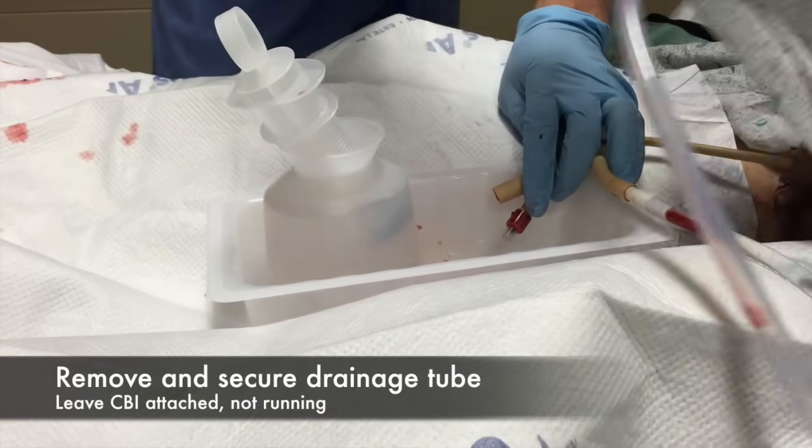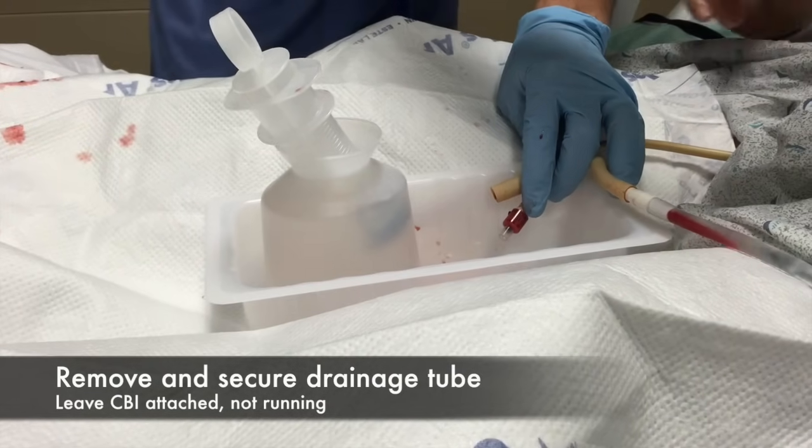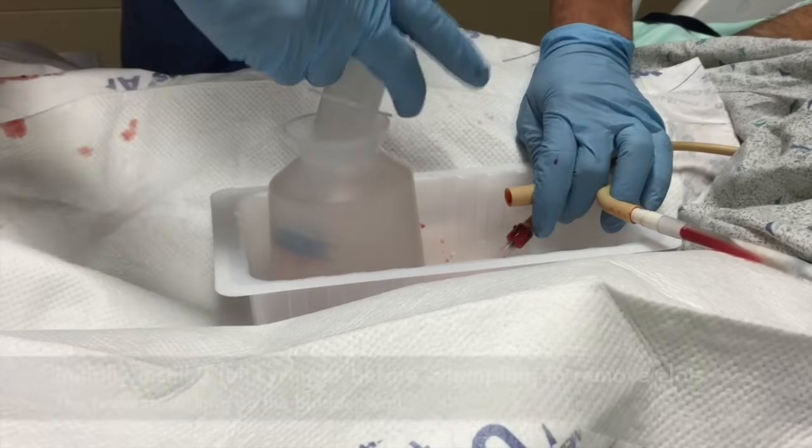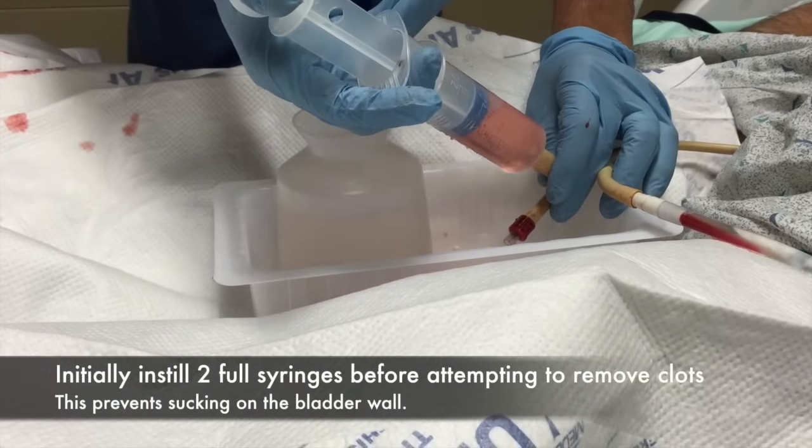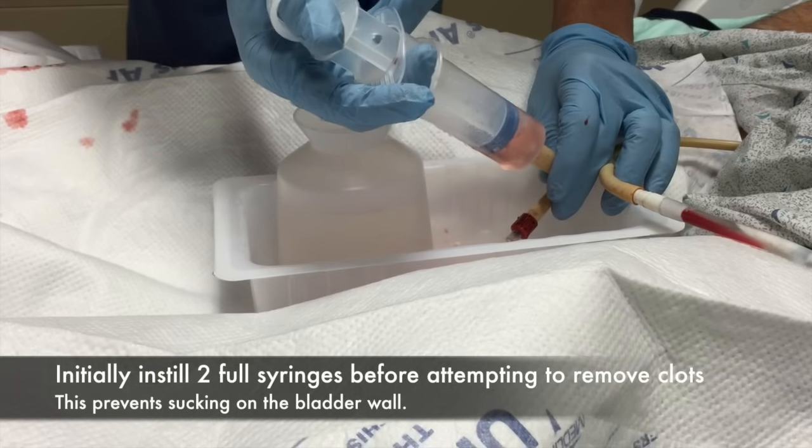We're using a three-way catheter, meaning it has an opening at the end that you can flush in and out of. This is generally the end that gets hooked to the leg bag or a drainage bag.